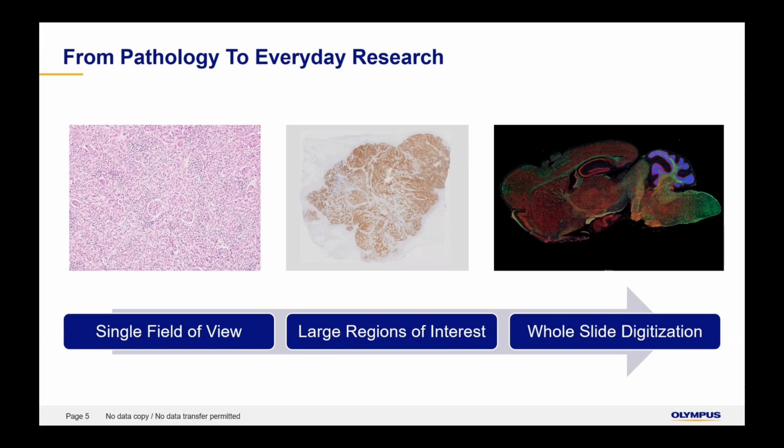In the past couple of decades, we've seen both the technology and the applications of slide scanning grow beyond the initial designs, which were largely focused on pathology and medical applications. Slide scanning is now a formidable primary research tool. It facilitates the processing of large amounts of data in a very reasonable time. Whole slides can be imaged in a matter of minutes, even at high mag. Importantly, much of this is hands-off time, in which the scanner is doing all the work while the researchers are free to work on other things.